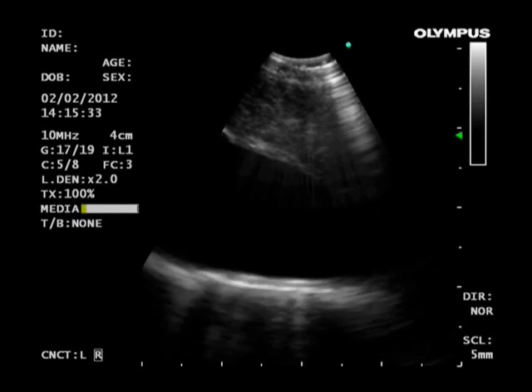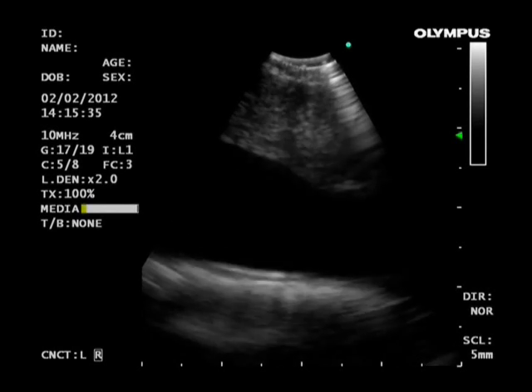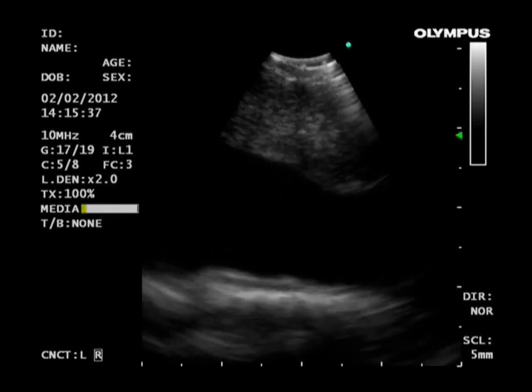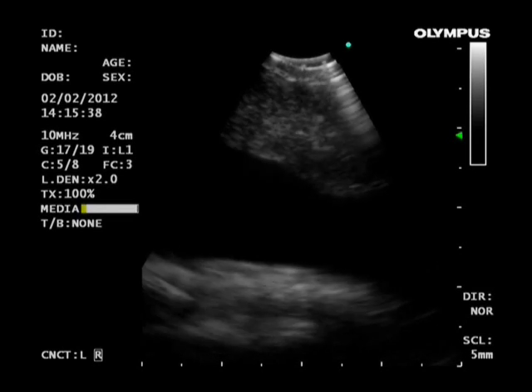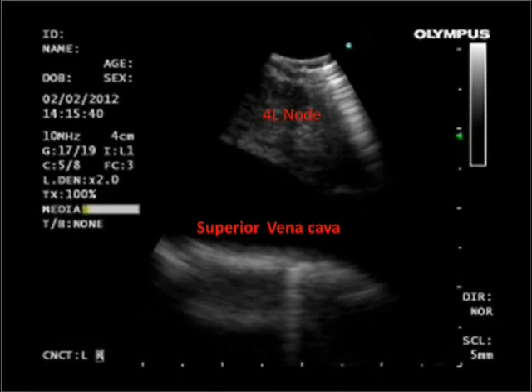With the scope oriented anterolaterally towards the right at the level of the main carina, superior vena cava collapsibility can be assessed. This video shows an enlarged 4R lymph node and normal variation in SVC diameter during respiratory phases.